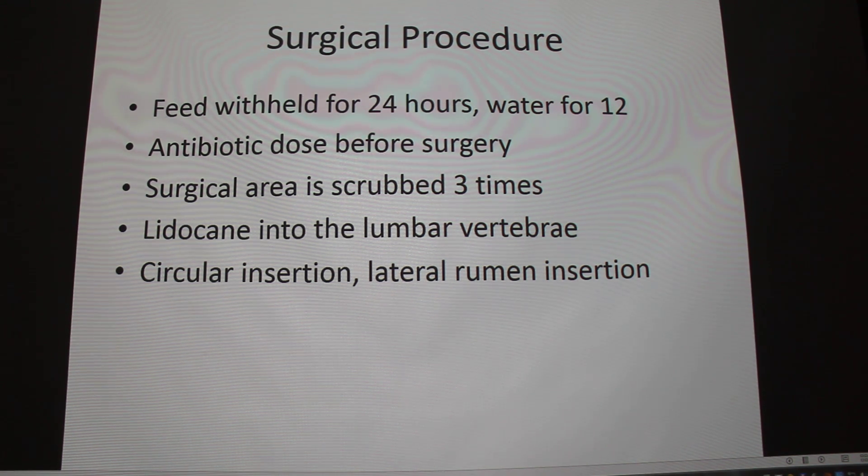You can start with either drawing a 4-inch cannula there — you can get 3-inch and 5-inch; 5 is pretty risky. Usually you start with 3 and they grow and stretch into a 4. So you make the circular incision — I actually watched a guy use a compass with a scalpel on it to make the incision. You cut into the layers, and it's kind of tricky because it doesn't matter how much you clean them, because as soon as you make that vertical incision into the rumen, the entire surgical area is compromised.